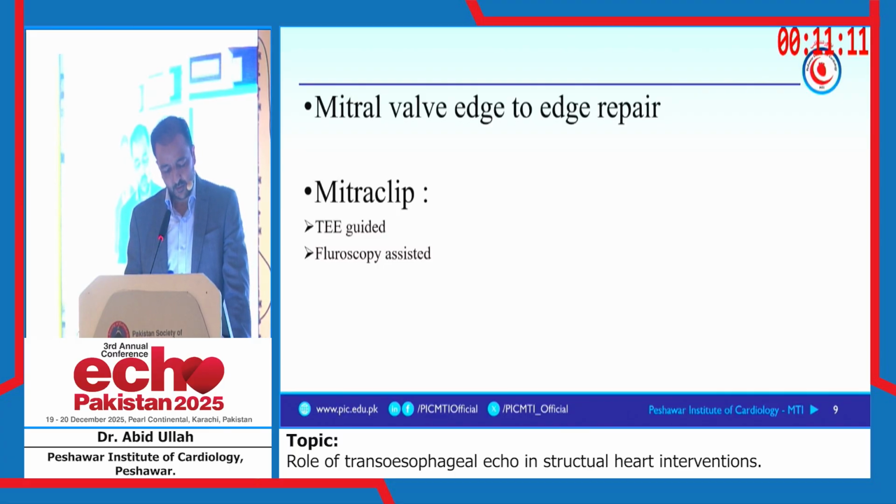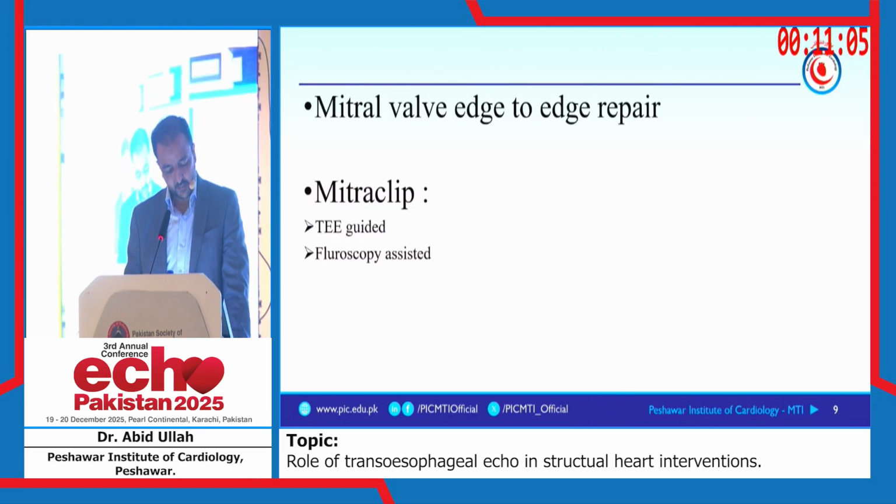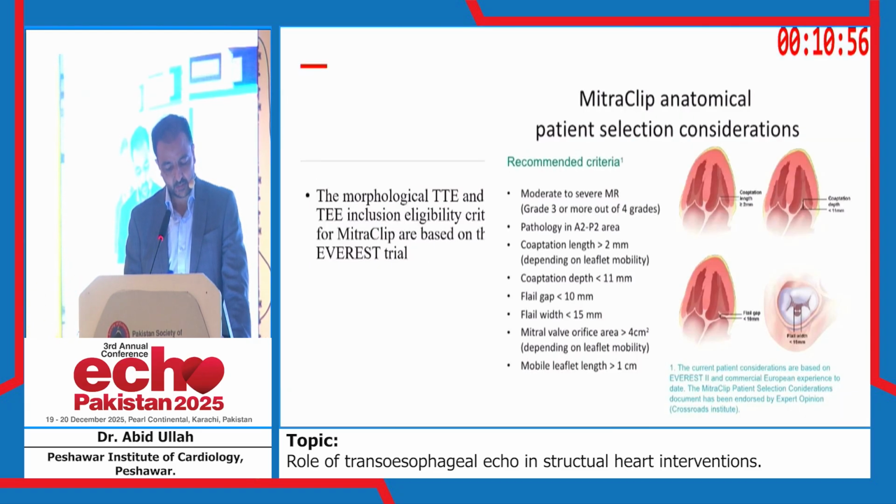So the main purpose of my talk is mitral valve edge-to-edge repair. The mitral clip is the most common of that, and I will be referring to it as the device for this procedure. And as I said, it's going to be TEE guided and fluoroscopy assisted.